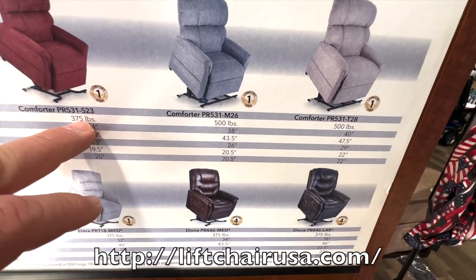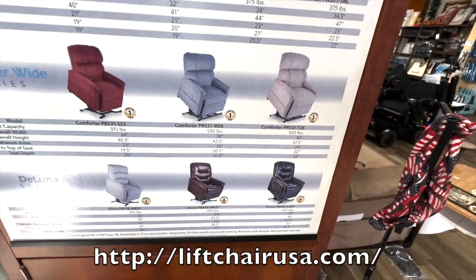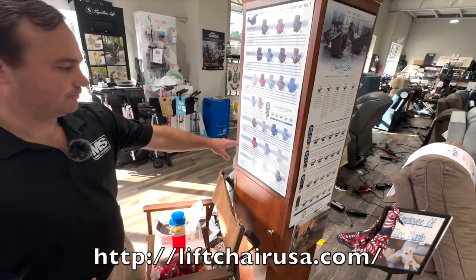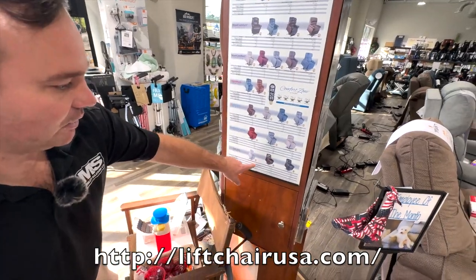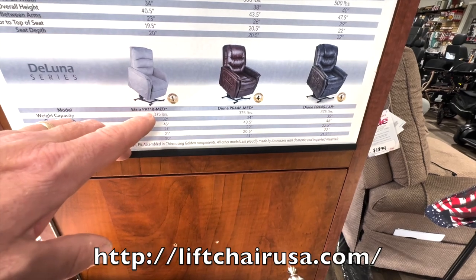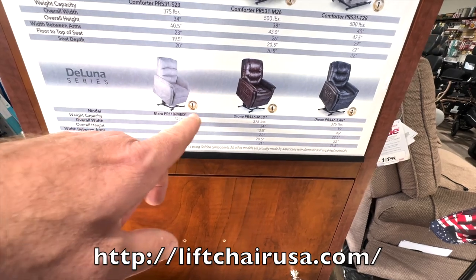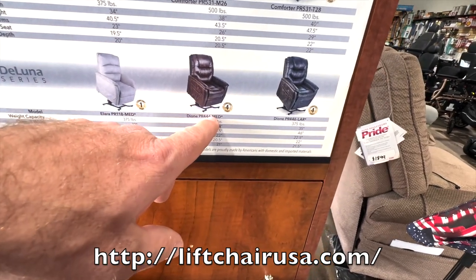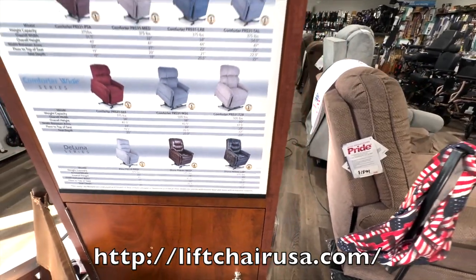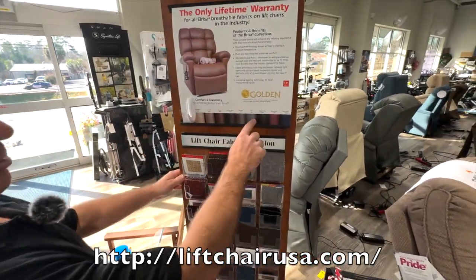We're still at 375 lb capacity with the petite and small wide, but 500 lb when you get up to the medium and tall wide. They do have a maxi comfort version of the wide in the comfort series, just in the medium size. Then you have your Deluna series, which is the overseas chair by Golden — the PR 118. They are changing these to a large and a small. There's also the Deluna 446 and the 446 large.